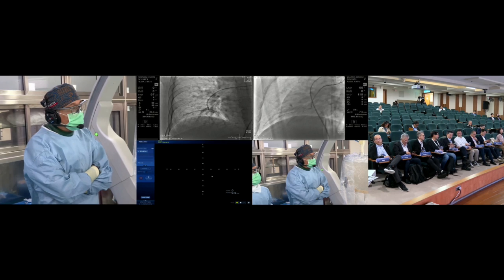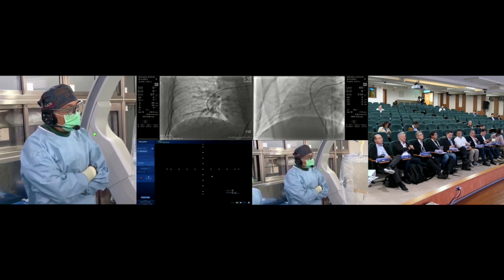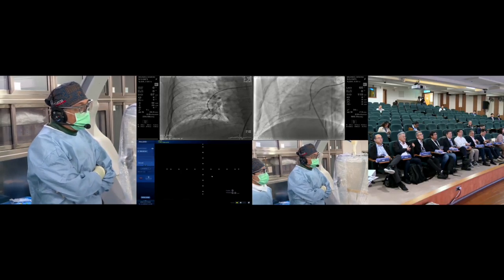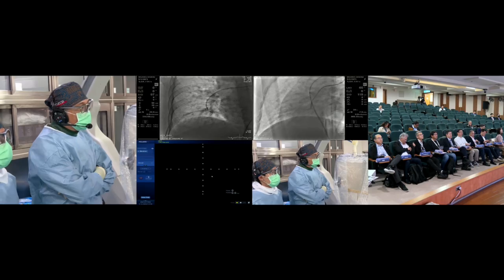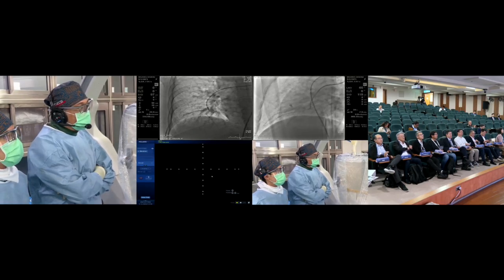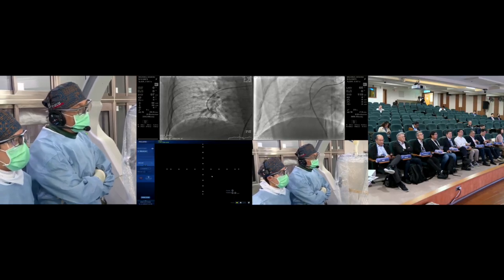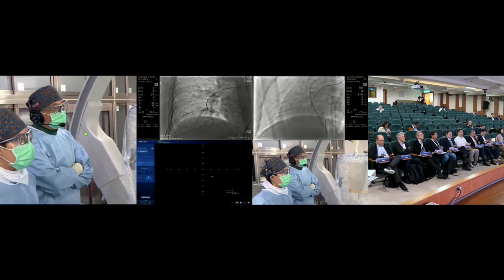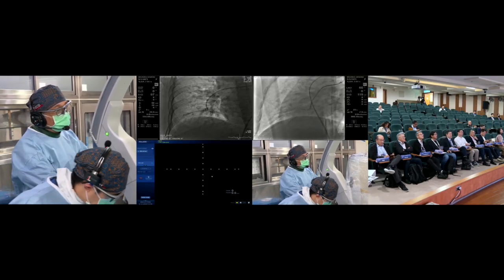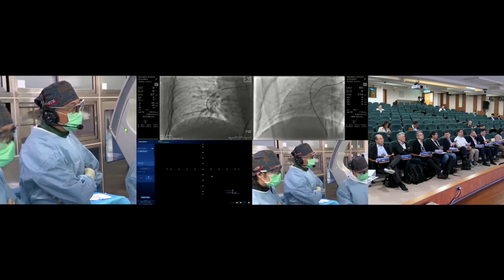And now we are going to search for other treatable lesions, because in addition to the A9 zone, not A10, it's A8 or A7, there is still some perfusion-free zone. So we are going to search for some more treatable lesions for the patient.